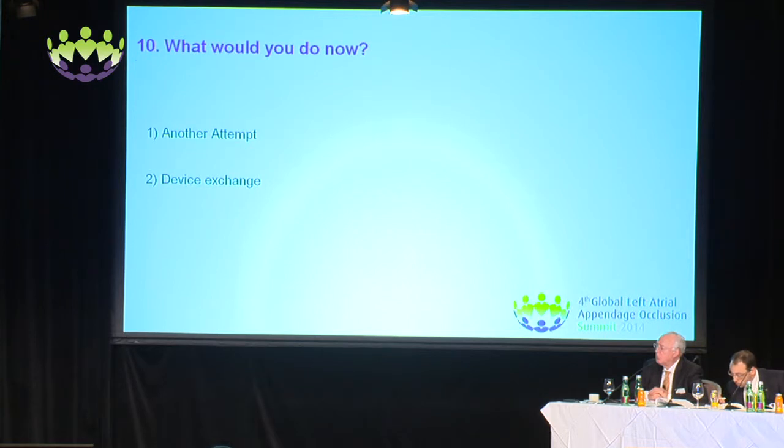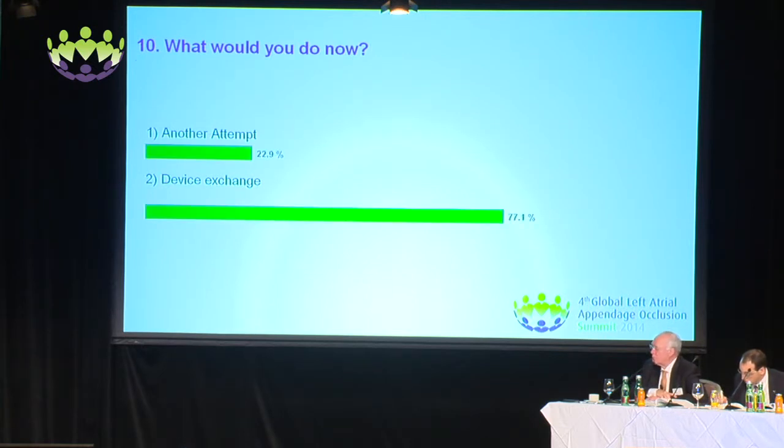Please vote. Because on the basis of the measurement, it's reasonable to use the 28. Okay, happy with the result? Change device.